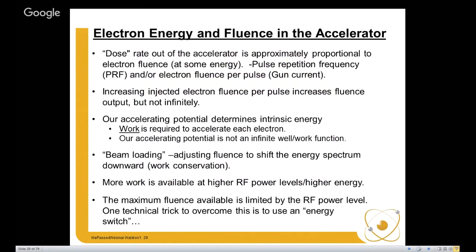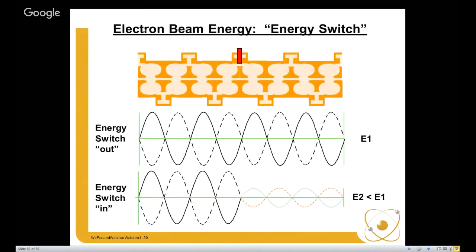One way that we can overcome this limitation is by effectively shortening our accelerator. Now here I have that same accelerator with this funny little red thing in the side cavity.